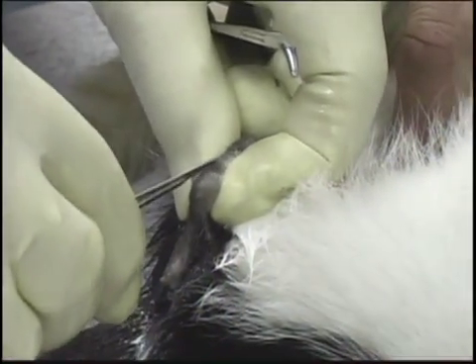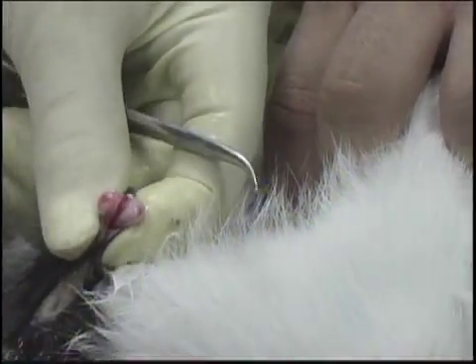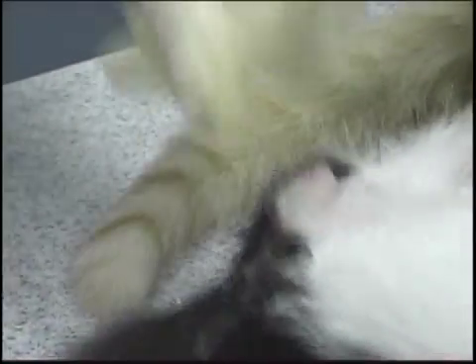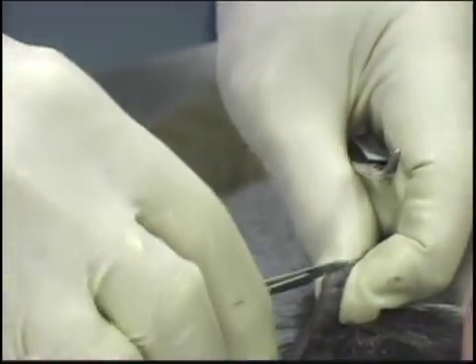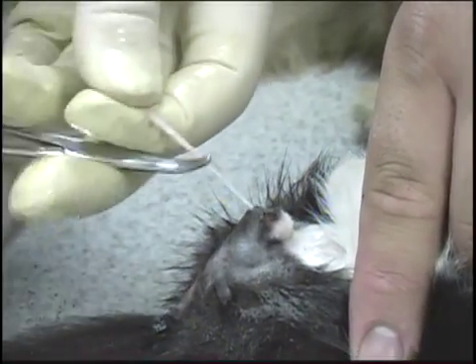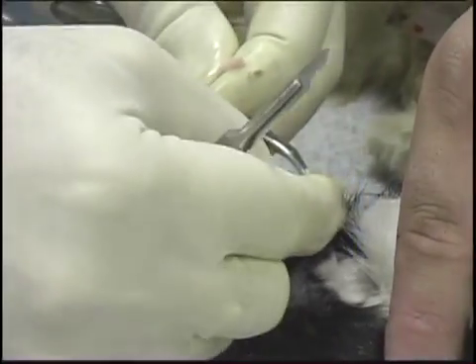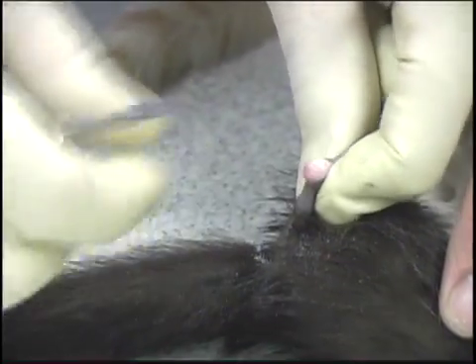This one is small enough you can actually pull these out by extraction. I make a single cut in this one and push them both out. Clamp them, and they can be removed by slow traction. When they are this small you have choices, but they can be a little slippery. When they are tiny you have to be careful because if they get away from you, gravity will just drop them right down. With practice and care that doesn't become a serious problem — your assistant would be able to take the spray and wash them down, but that is not what we really want to do.